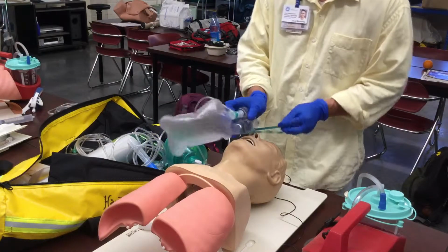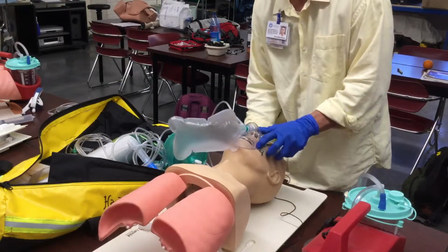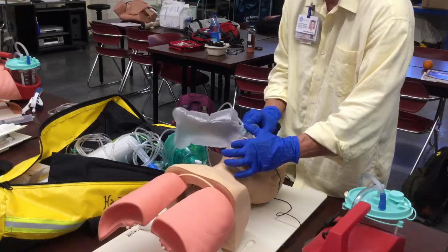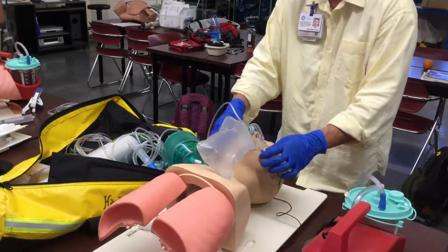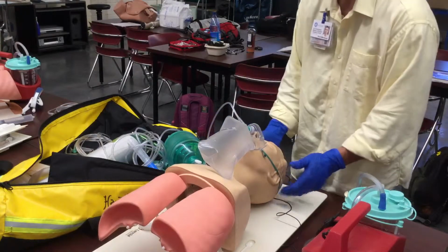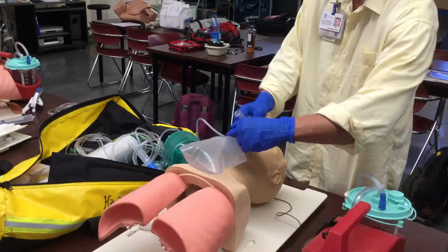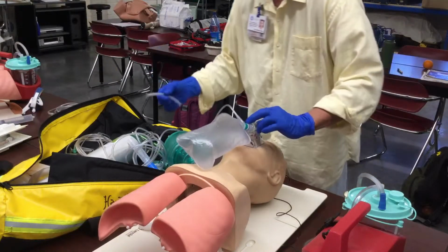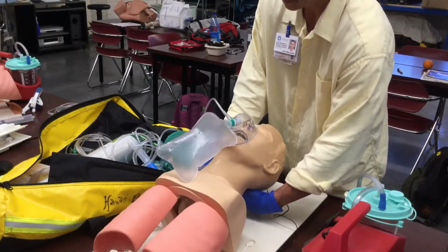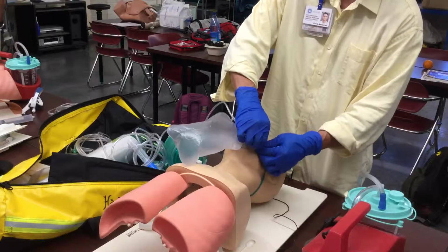Inflate the bag, go ahead and place the mask over the patient's face, strap around the patient's head. Make sure there's a proper seal, the mask to face. Monitor my patient's breathing. Should he start to be irritated with the nasopharyngeal airway, I'll just have that removed.